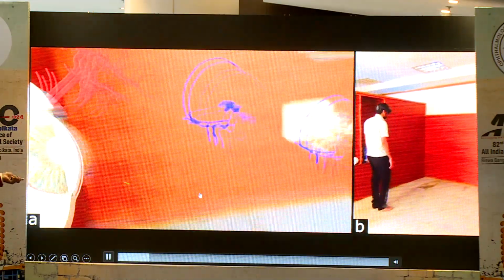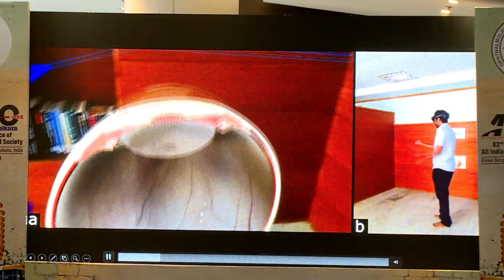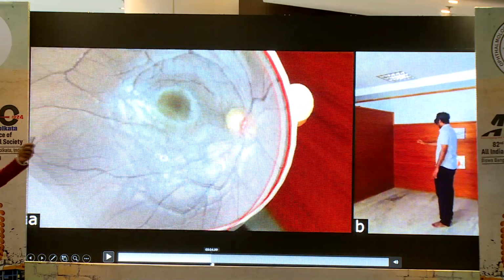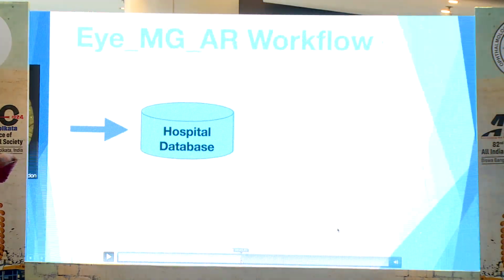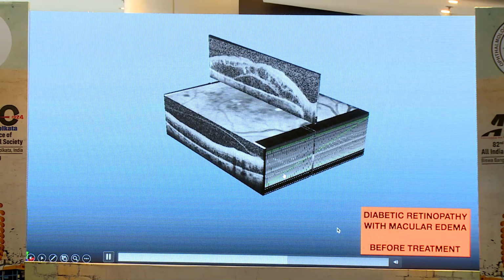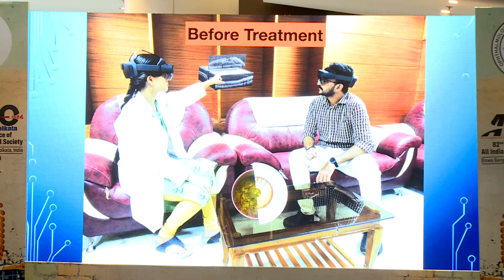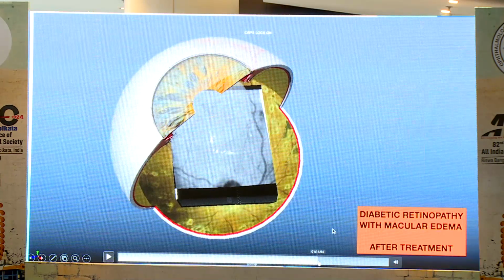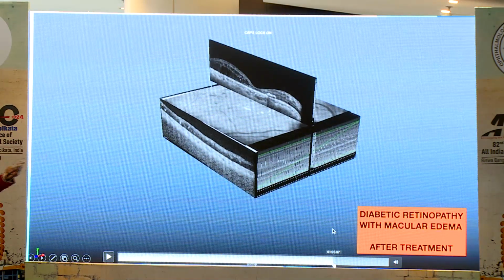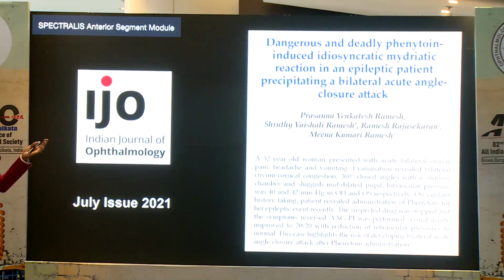We are trying to incorporate the Anterion images for anterior segment imaging with the headsets that we have. Slowly but steadily we have started to make evolution into anterior segment imaging, so that not only the posterior segment that retina and OCT give you, we need to go into anterior segments as well. And as a glaucomatologist, my area is more of that. But obviously, as Unni sir covered, all multimodal imaging can be worked with it.